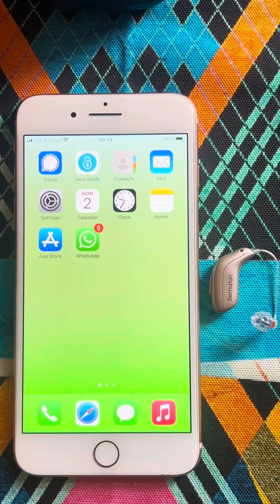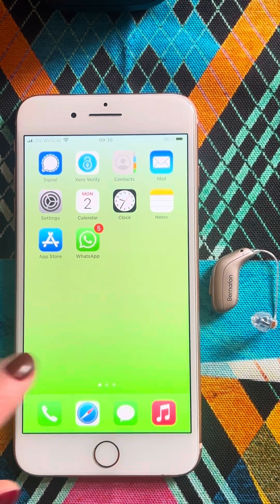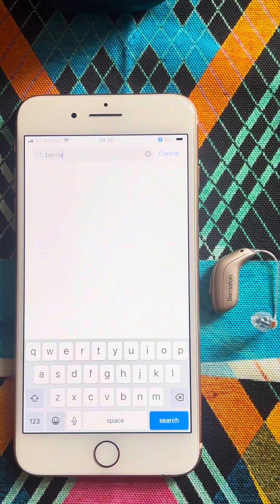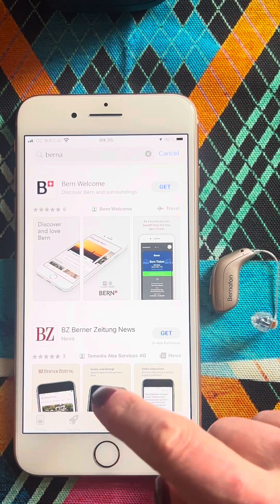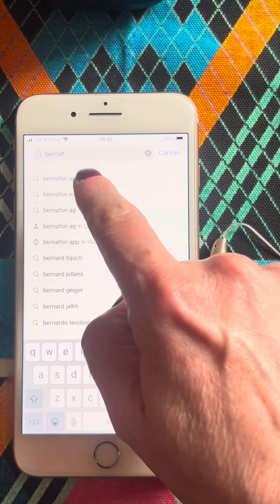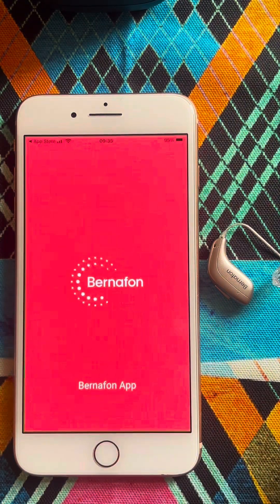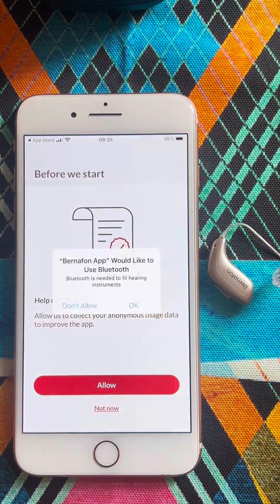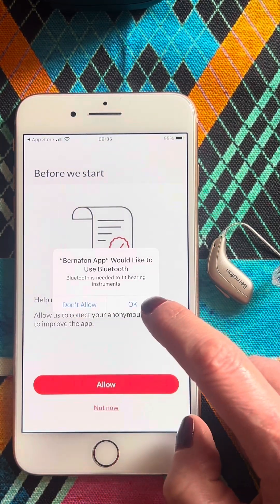In this video, I'm going to show you how to connect your Bernafon hearing aids to the Bernafon app. The first step is to pair the hearing aid to the iPhone. Next, we will come to the App Store, type in Bernafon, and we will be looking for this app over here. The first thing you would like to do is allow the notifications, and the app will need to access the Bluetooth.